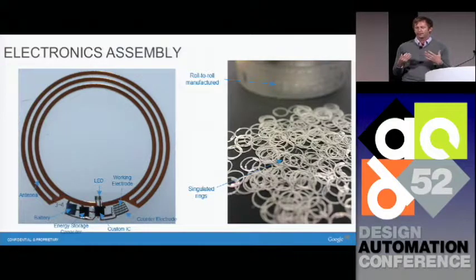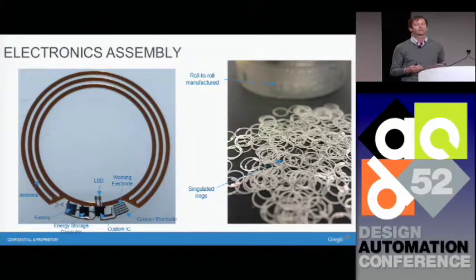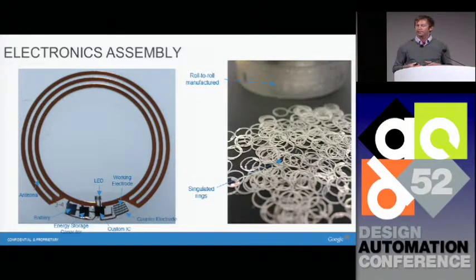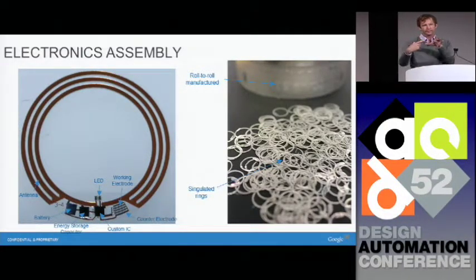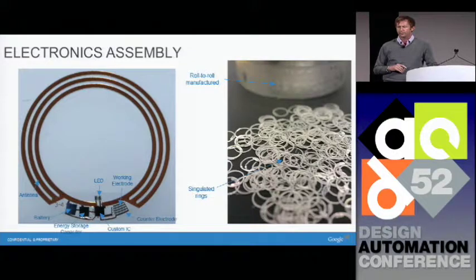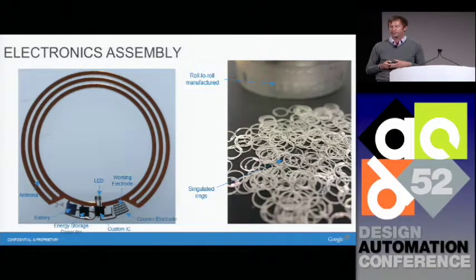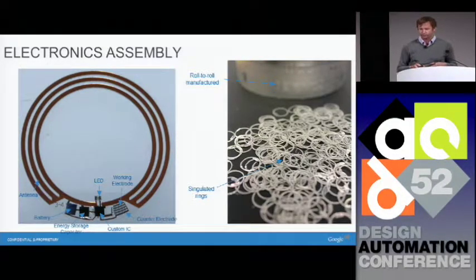And there are, fortunately, a few different ways of manufacturing these devices. Again, in addition to size, cost is extremely important. Daily disposable contact lenses are less than a dollar each, so we need to be compatible with an extremely low-cost process. We've worked on a couple of different ways of doing this. Thin film fabrication on top of silicon wafers, where the silicon is used as a handle wafer, is one way of doing it. We've also worked on roll-to-roll manufacturing processes, similar to how standard RFID tags are manufactured. But there are fortunately a lot of different options for making devices that are extremely thin, dirt cheap, and biocompatible.